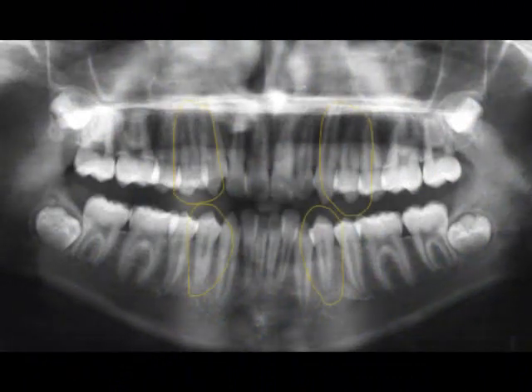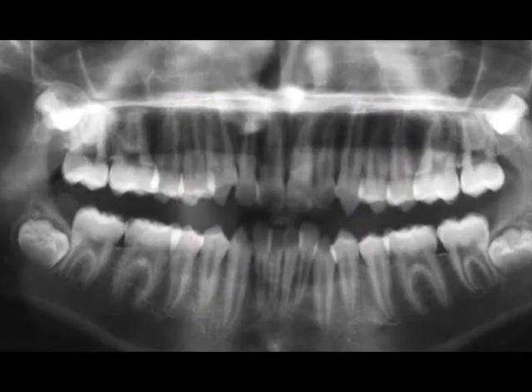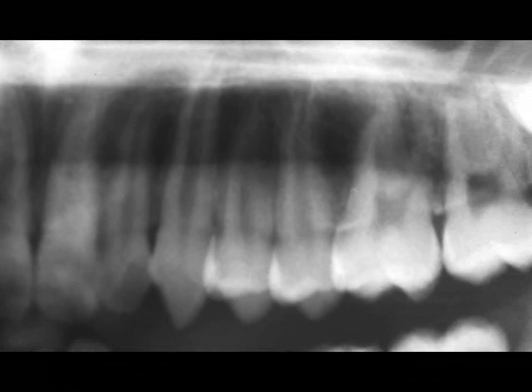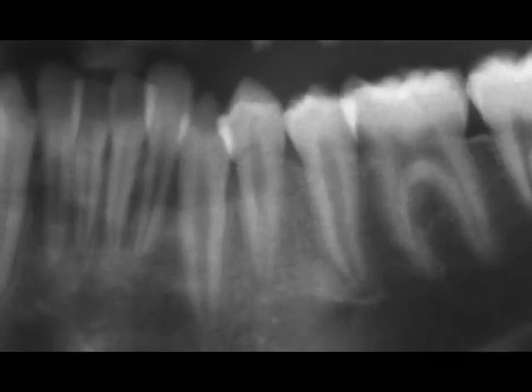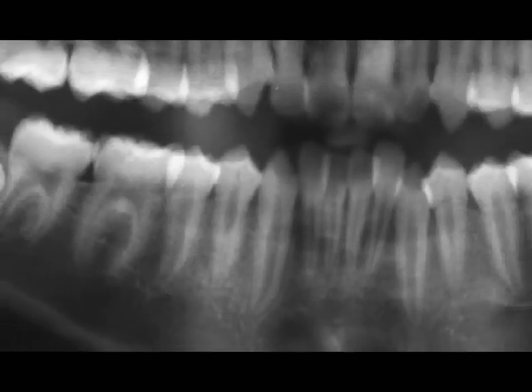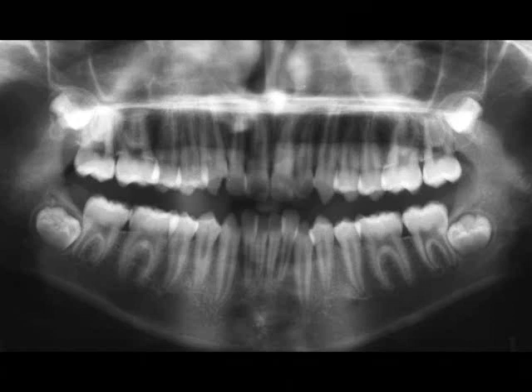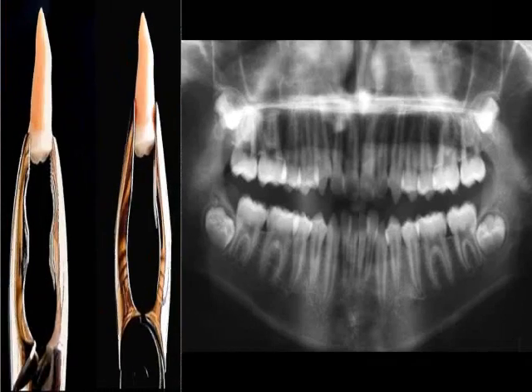Let's look at a panoramic radiograph of this patient. We see that we're going to be taking out the four first premolar teeth, numbers 5, 12, 21, and 28, and we'll look at them in a little bit more detail. Tooth number 5, you can see that the root apex is almost completely formed, and same thing goes for number 12. It actually looks a little bit more formed. Number 21 has a pretty well-formed or almost completely formed apex, and the same goes for number 28. Still, we have to be very conscious of the root tips and not take for granted that the root tips are not fully developed, because we may get surprised.